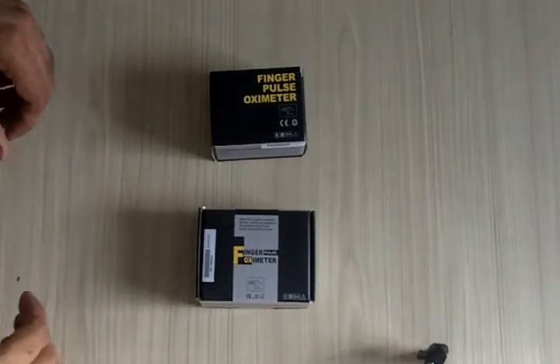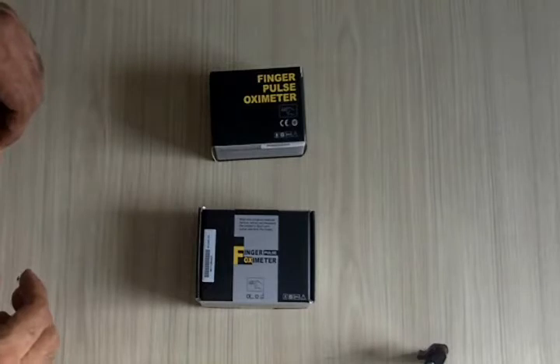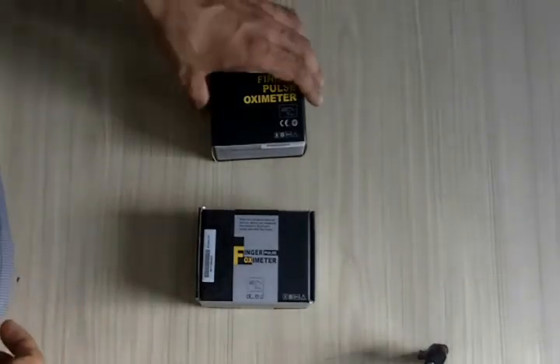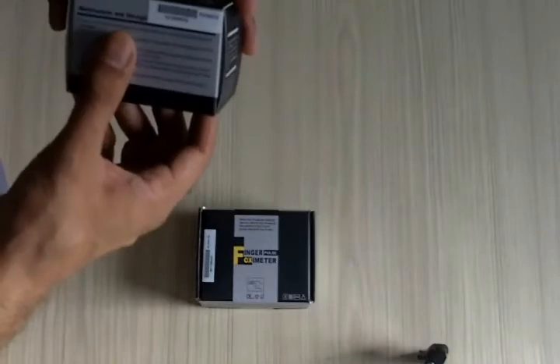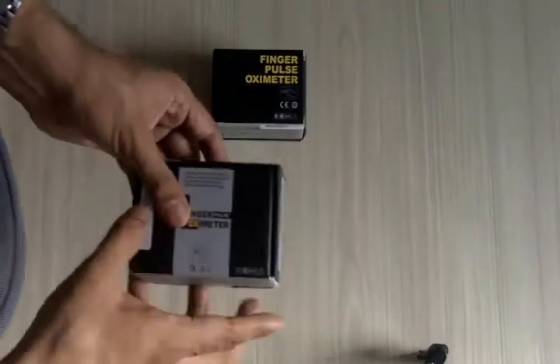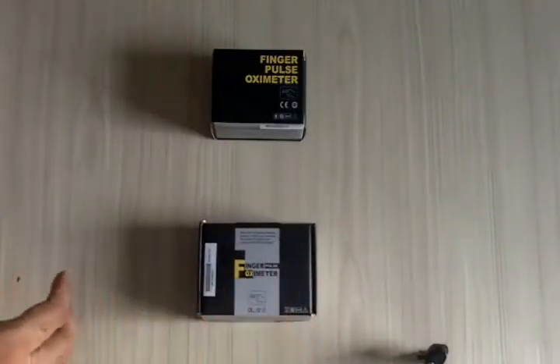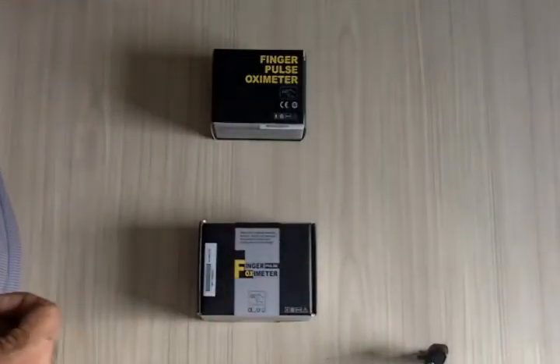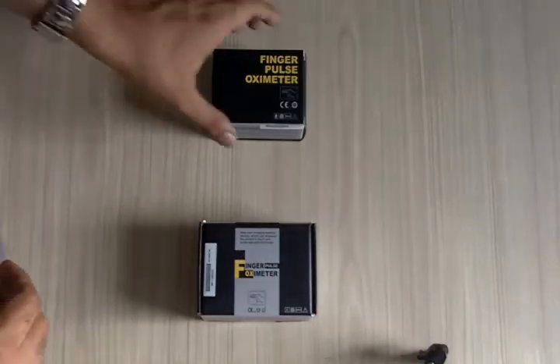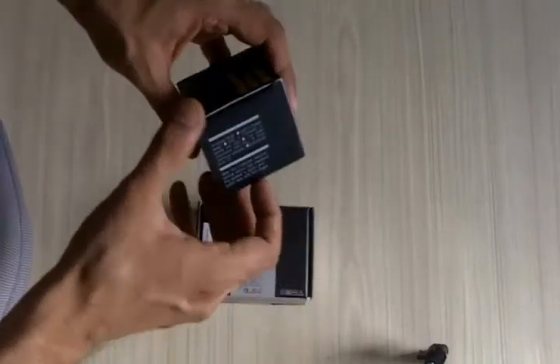Hi everybody, we would like to give you a quick demonstration of two very popular pulse oximeters. One is the MD 300 C26 and the other is the MD 300 C3A. They're both fingertip pulse oximeters from a company called ChoiceMMed, which incidentally is the world's largest manufacturer of pulse oximeters.